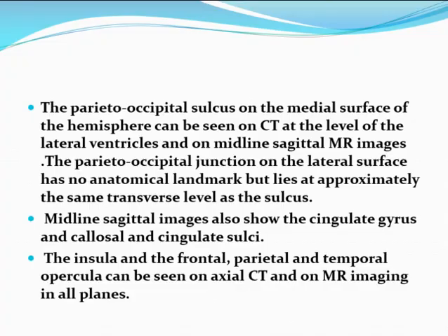The parieto-occipital sulcus on the medial surface of the hemisphere can be seen on CT at the level of the lateral ventricle and on midline sagittal MRI images. The parieto-occipital junction on the lateral surface has no anatomical landmark but lies at approximately the same transverse level as the sulcus. Midline sagittal images also show the cingulate gyrus.